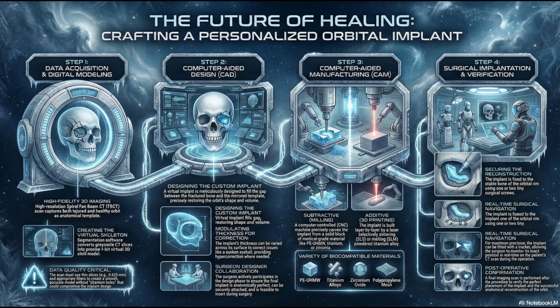methodology. Because while hypercorrection is complex, let's go back to the technical nightmare of getting an accurate segmentation in the first place. Turning that grayscale CT image into a measurable, solid model. The biggest problem here is something called pseudo-defects. False holes. They show up all the time in the super thin walls of the orbit. Yeah, the paper-thin walls, especially on the floor and medially. The scanner has trouble resolving them.